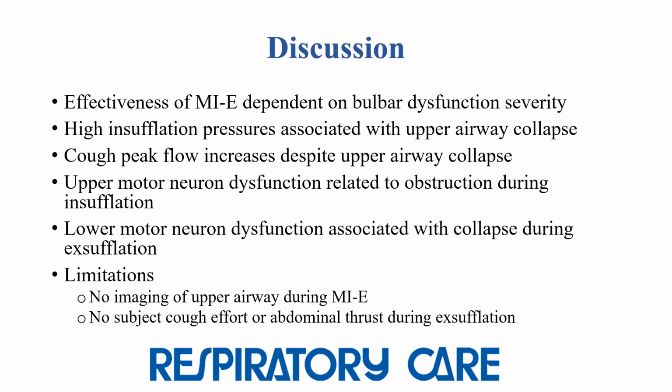Some of the study limitations were that there was not any imaging of the upper airway to compare with the graphics obtained during MIE, and this is needed to confirm the correlation of the results with anatomical changes during MIE therapy. Additionally, subjects were asked to remain passive during therapy sessions without any type of cough effort.